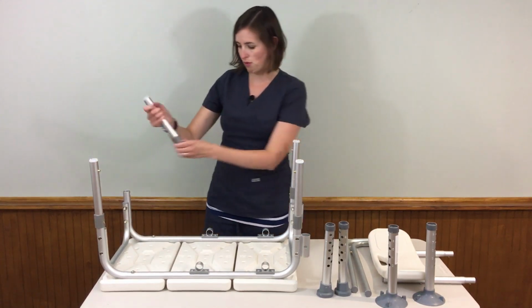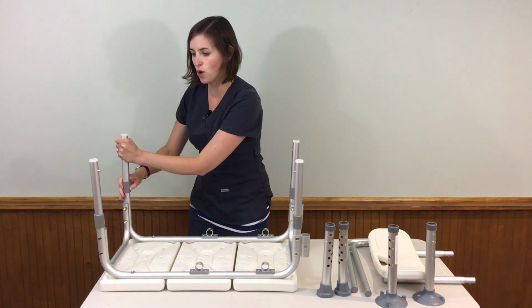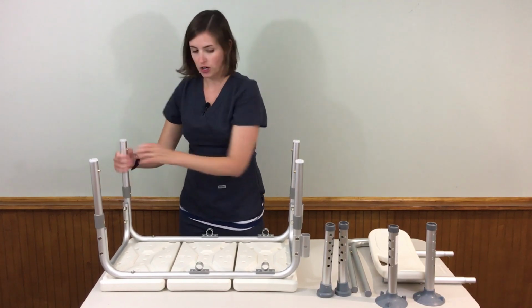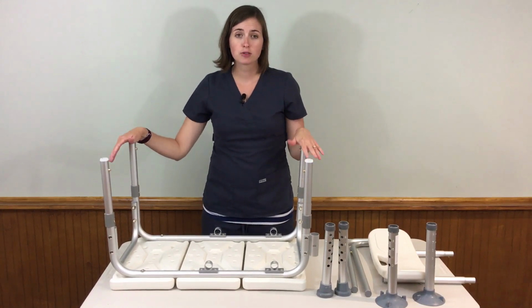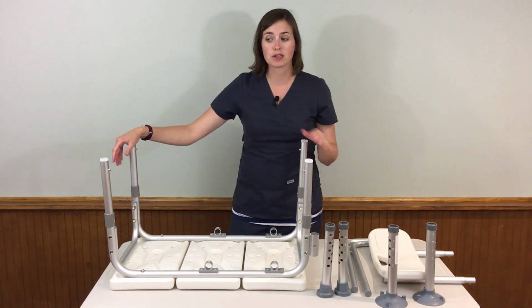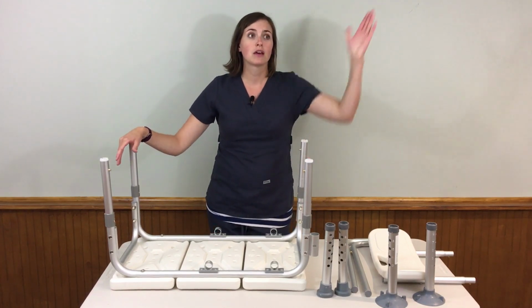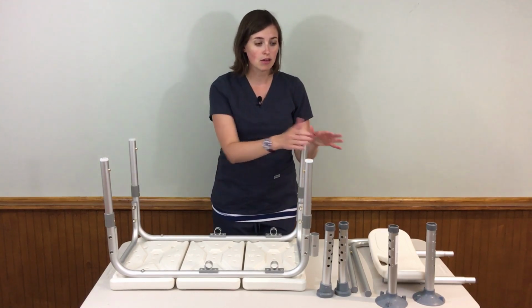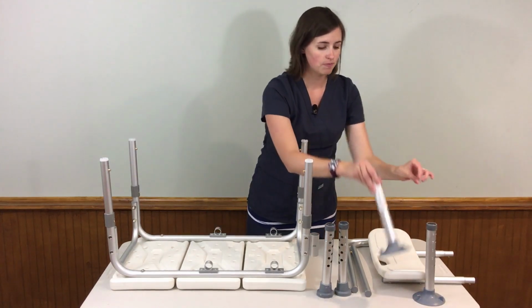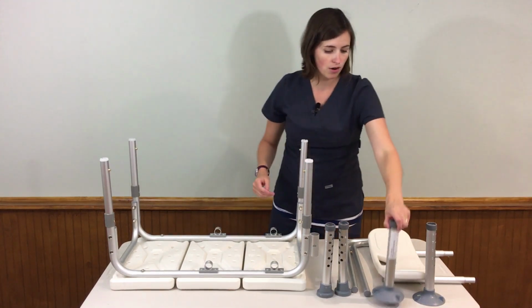Okay, 1 more. And these go in pretty tough, and they're supposed to because they really are meant to hold very steady. Okay, so now, easy part's done. At this point, we're going to install the feet and the backrest. You should know what tub you're putting this in and where the shower head is going to come from, because you need to know which side needs the special suction cup feet. So in this situation, I'm going to put the suction cup feet on the left side here.